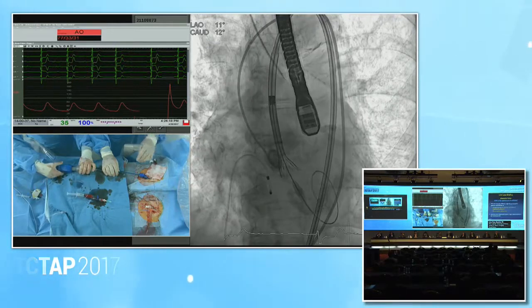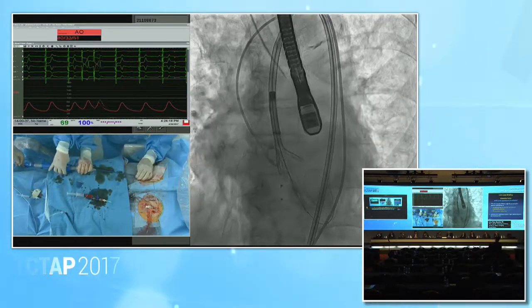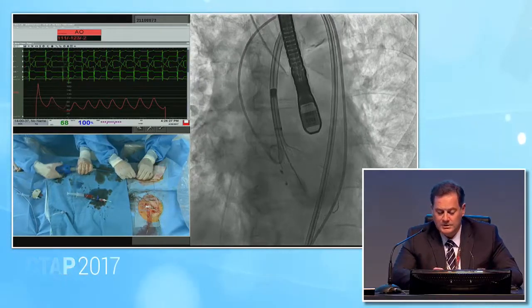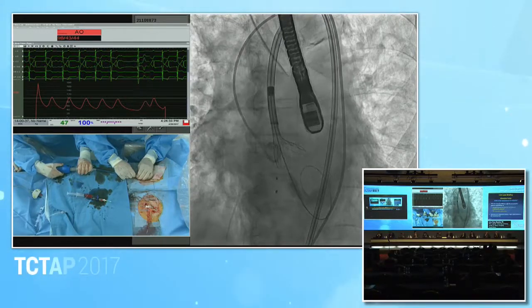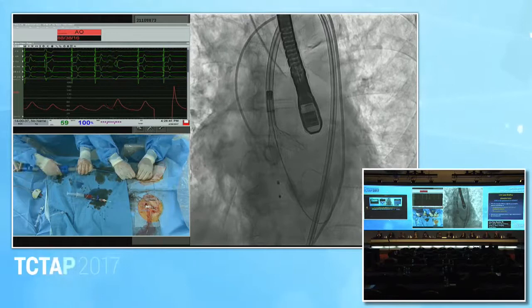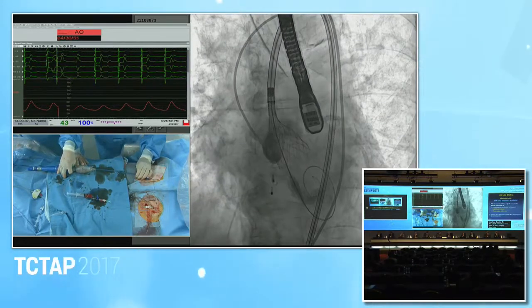Don't go any further down, I suppose. You can see that we've triggered some heart block there, and that may be some pressure on the conduction system and the non-coronary cusp. So even at this point, manipulation in that region can cause temporary heart block. Okay. I think they stay pretty good right under the annulus, quite shallow. Yeah. The bradycardia is actually working for you, really. It's giving you the time to deploy.